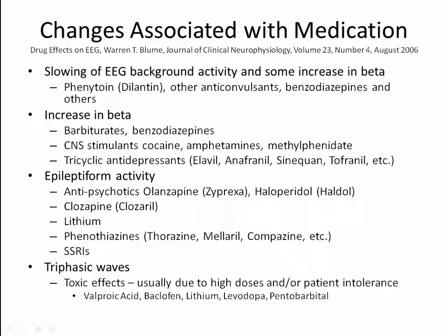Now, as we'll see in some of the subsequent slides that I'll be showing you, quite frequently medications, even those that you wouldn't expect to do so, will cause an increase in beta activity, and sometimes, in fact quite frequently, an increase in the fast beta frequencies. Now that seems somewhat unexpected, but we'll talk about that.